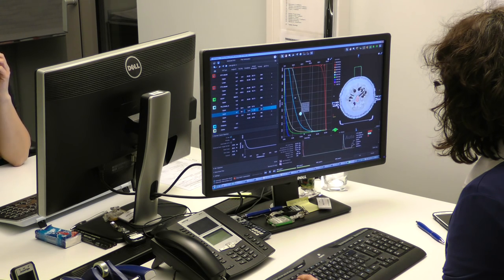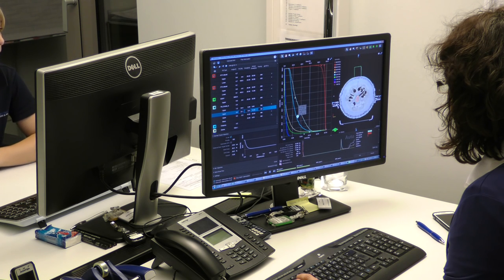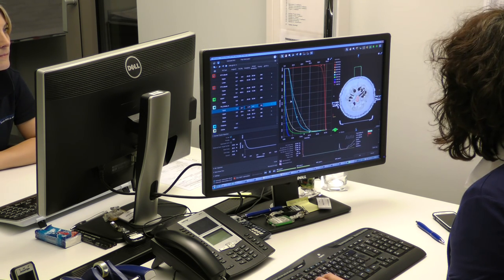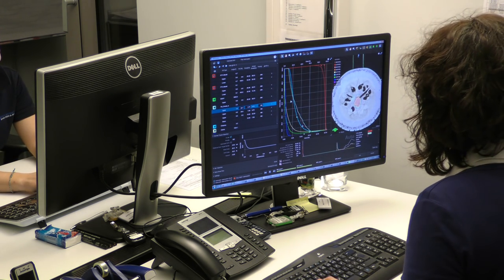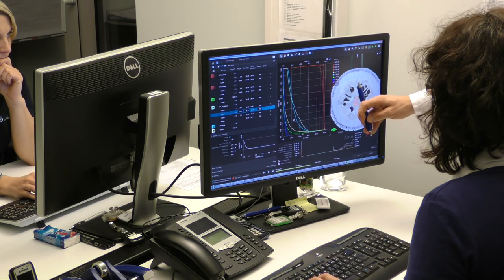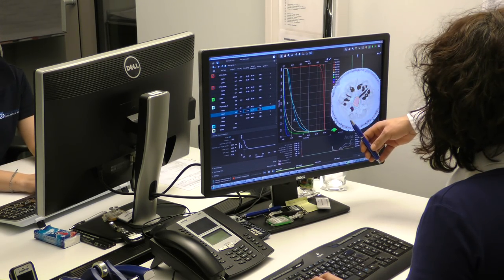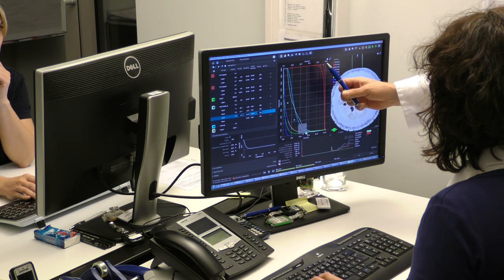Now she is doing the planning, using the data from the CT and the volume that was painted in. Everything will be computed. This is our radiation plan.